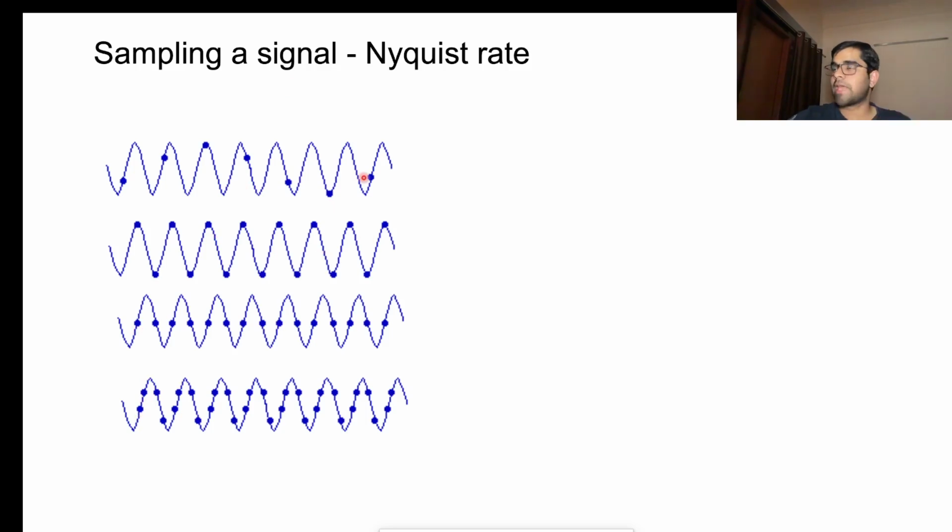So this is called sampling. Sorry, but this has a continuous amplitude over time. What if it changes in very short times? How do you decide the Nyquist rate then? How do we decide the Nyquist rate? By knowing the maximum bandwidth of a signal.